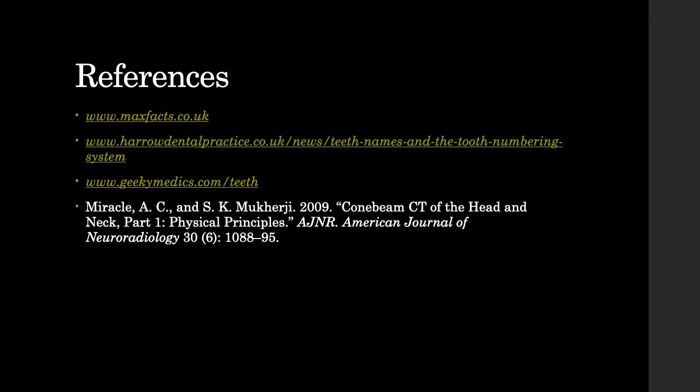And the paper below was just quite interesting. That's where I got the information on cone beam CT. So if anyone wants to read a bit more about how that works and the physics of it, it's quite a good read and it's quite interesting. I find it very useful, and that's where I got the image of the cone beam from as well.